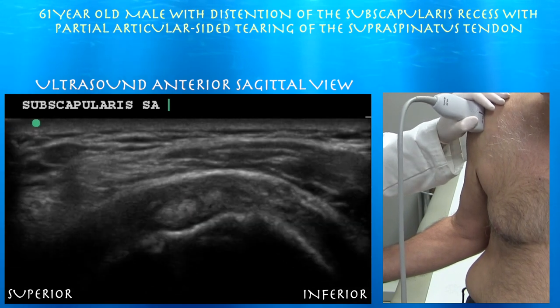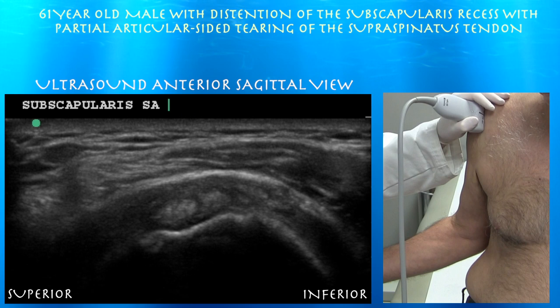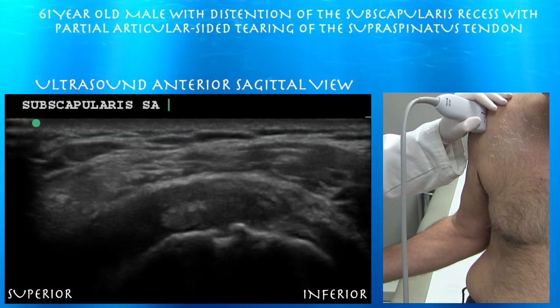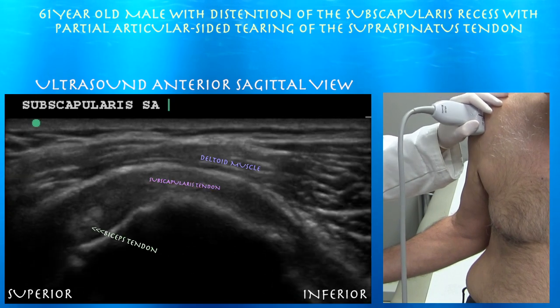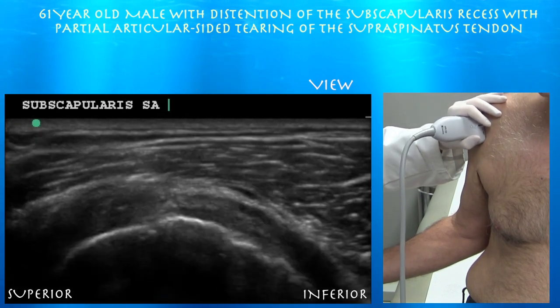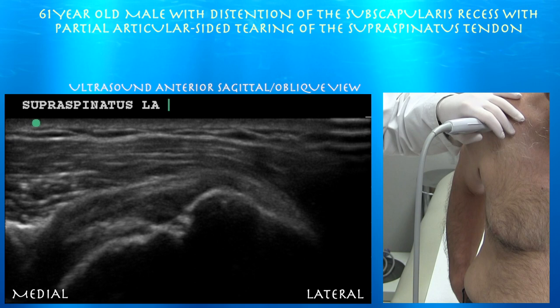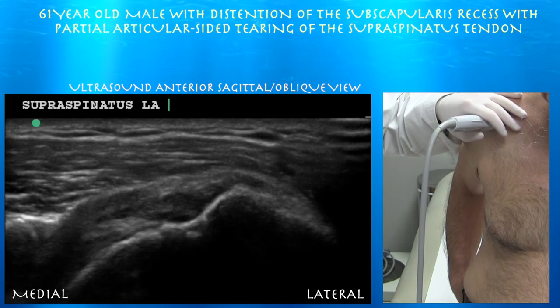Looking at the subscapularis tendon — here you can see the interval with the biceps tendon, and then inferior to that you see the subscapularis tendon. Here is just another view to get a better look at the subscapularis tendon; if you go inferior to that you'll get your subscapularis tendon. Here at the very distal anterior supraspinatus tendon you can see some small partial tearing of the articular surface of the distal supraspinatus.